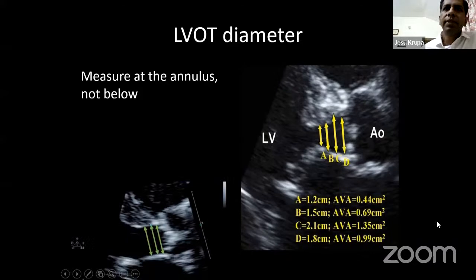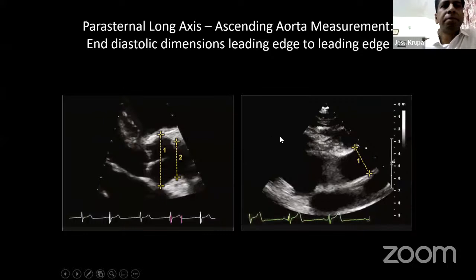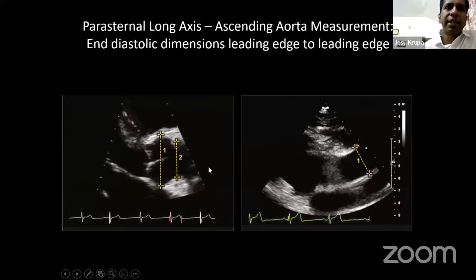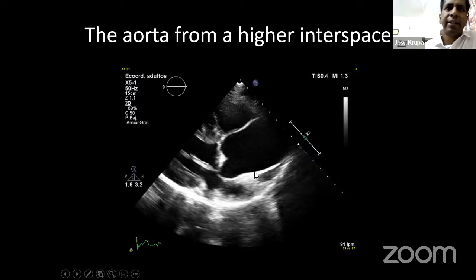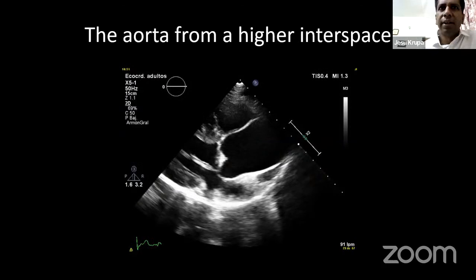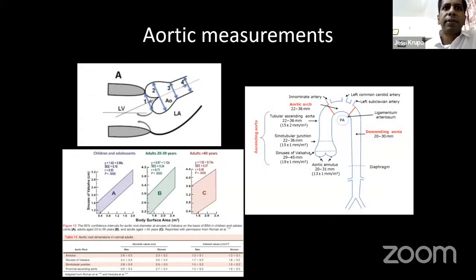Moving on to further measurements in this view: the sinus of Valsalva, the sinotubular junction, and beyond that the ascending aorta. Going up one intercostal space higher, you see the aorta much better — the aortic valve, the sinus of Valsalva, the narrow waist of the sinotubular junction, and the ascending aorta. This view gives information about dissections and aneurysms. There are different tables, charts, and nomograms from society guidelines which we routinely follow.